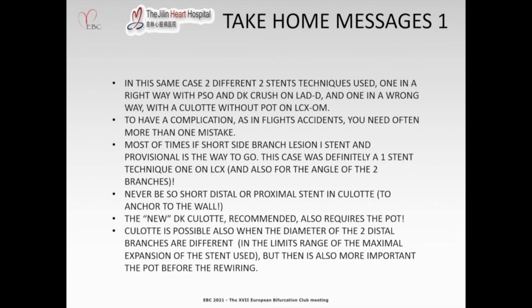In this same case, different stent techniques were used, one in a right way with PSO and DK crush on the LAD, and one in a wrong way with a culotte without POT on the LCX OM. To have a complication, as in a flight accident, you often need more than one mistake.